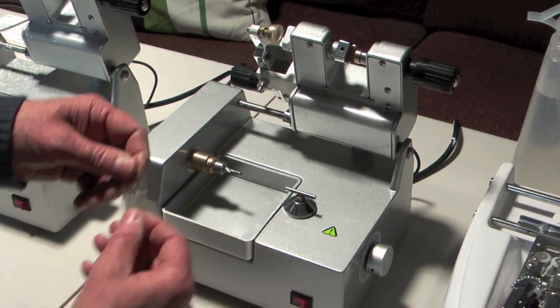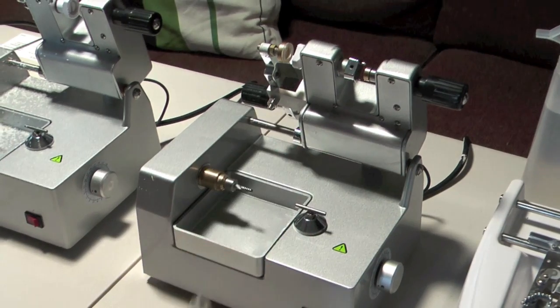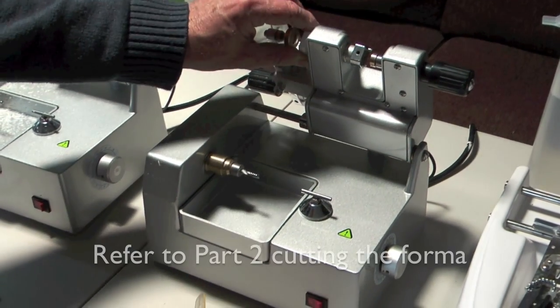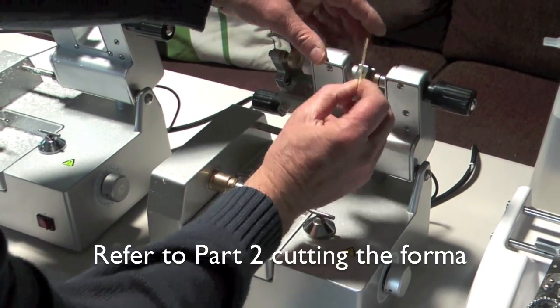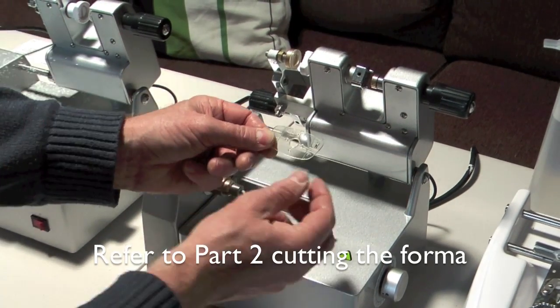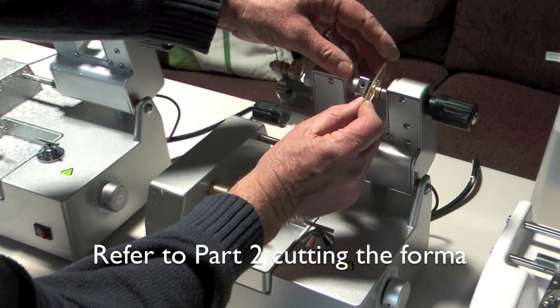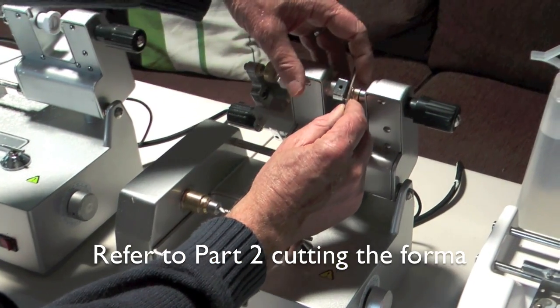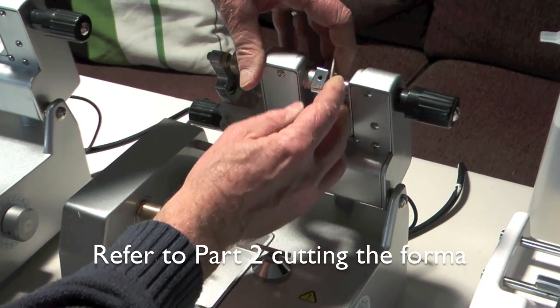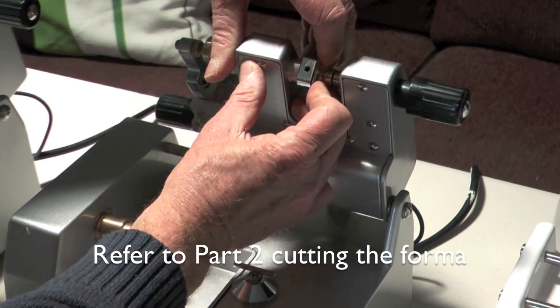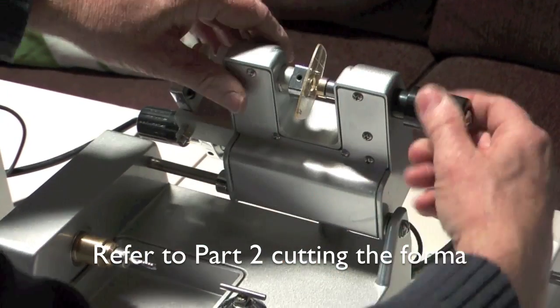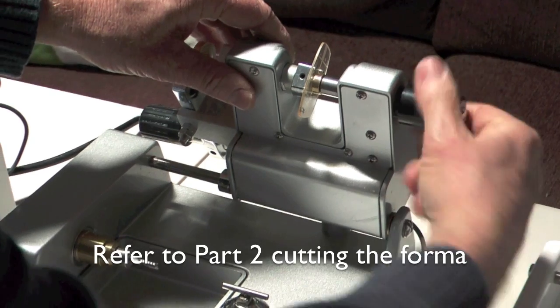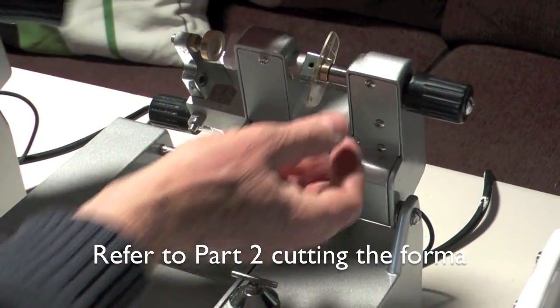So, the next stage is that we have to cut the lenses, and this is the lens cutter. We put the shape that we just created earlier on from the original lens that came out of the frame, and that just fits on. It's quite firm, but that will go on there, and that will provide the shape that we need.